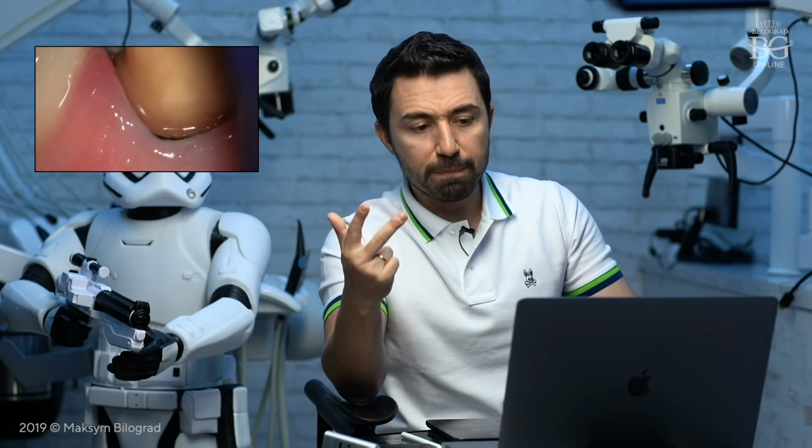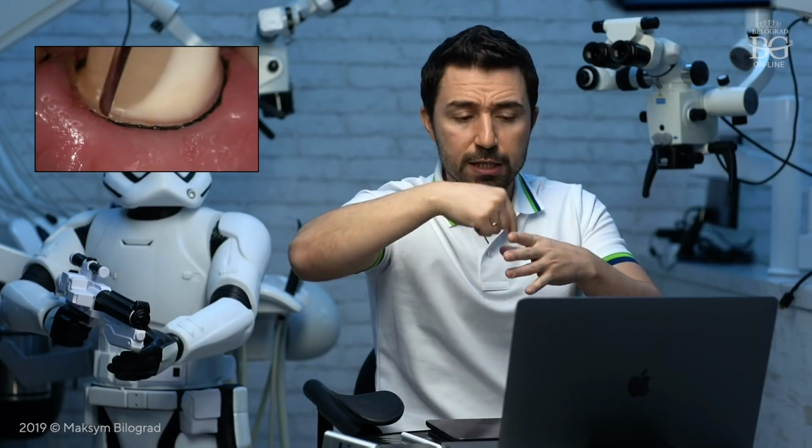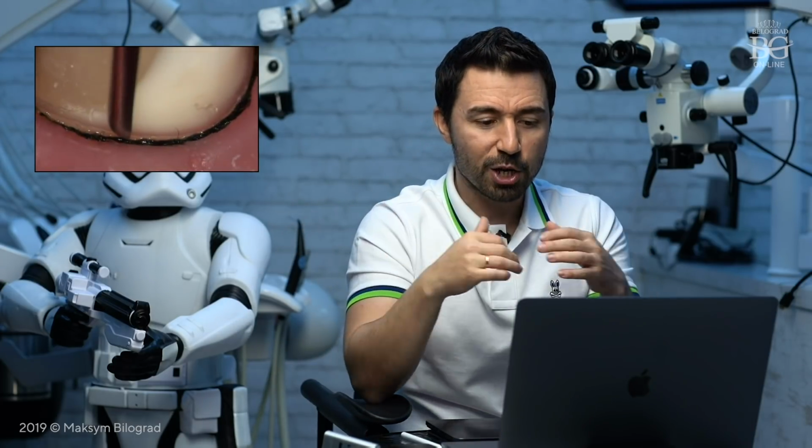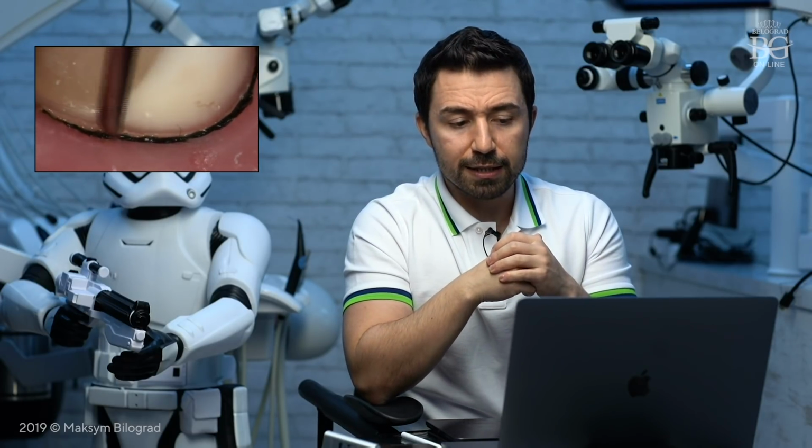And rule number 3, the bur has to be fine or ultra fine. So a red stripe bur or yellow stripe bur. In this case, it will not scratch the rubber dam that much, and the helicopter effect will be, actually you may skip the helicopter effect, as you can see I skipped it in that clinical case.